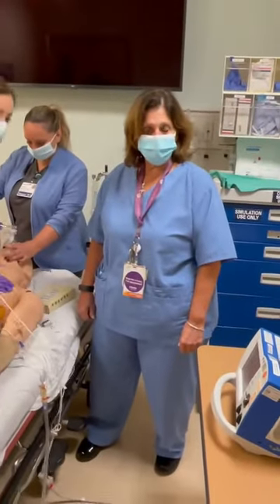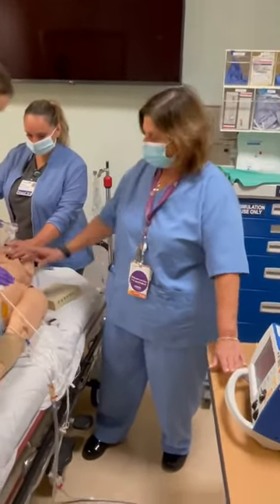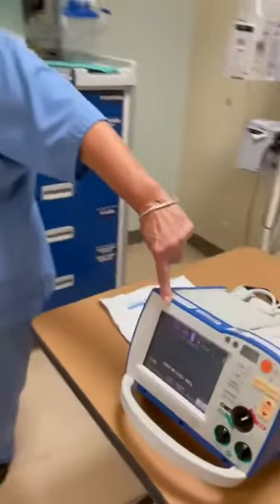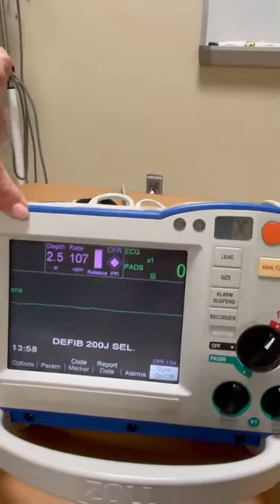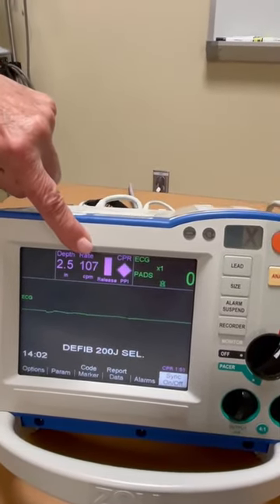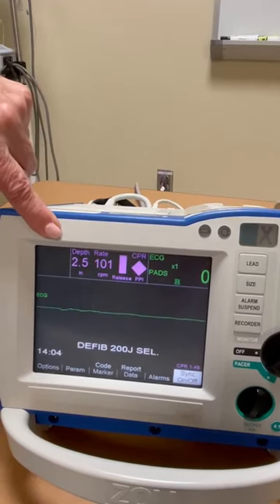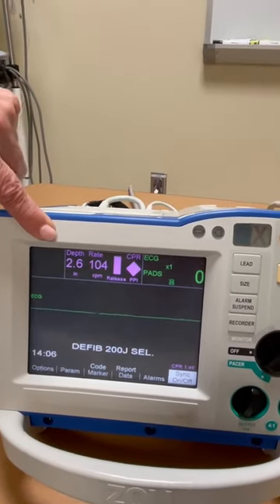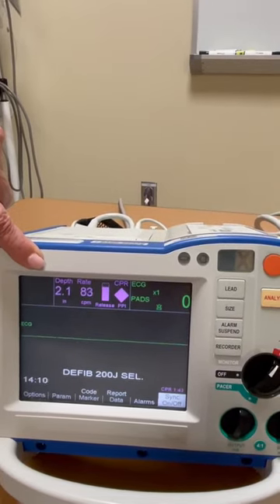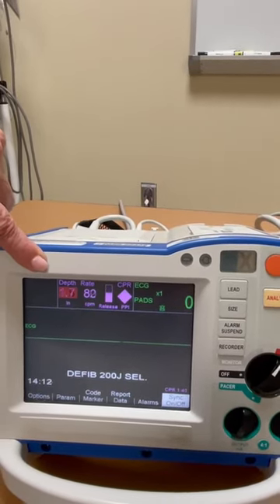Just some important steps to remember. When you're getting compressions, remember that on the Zoll monitor, it is going to measure for you in the purple box the depth and the rate of compressions. It will only call out if the depth is not sufficient enough — 'Push harder.'